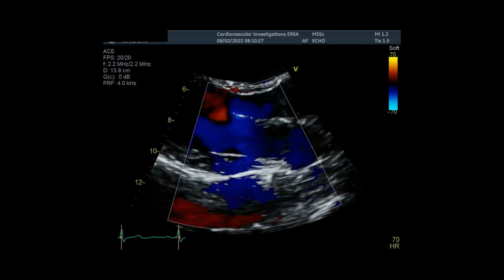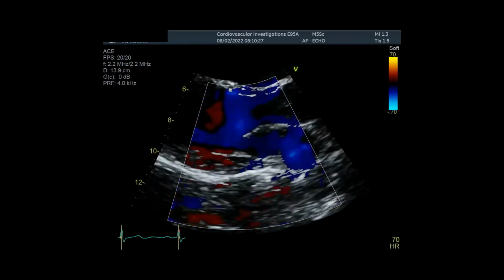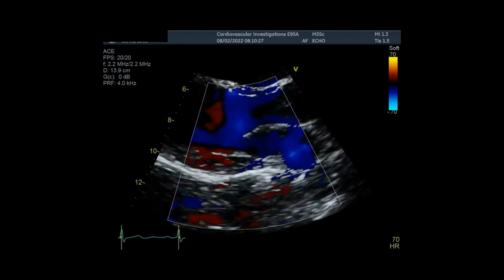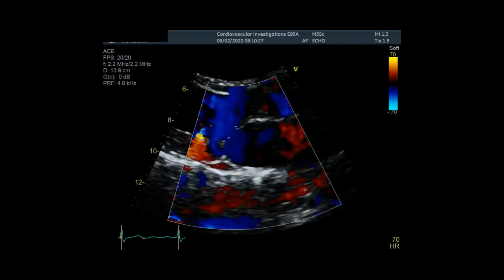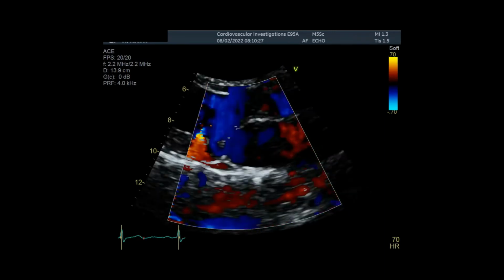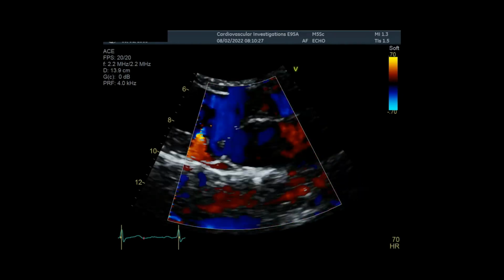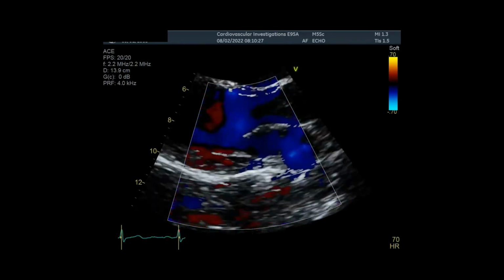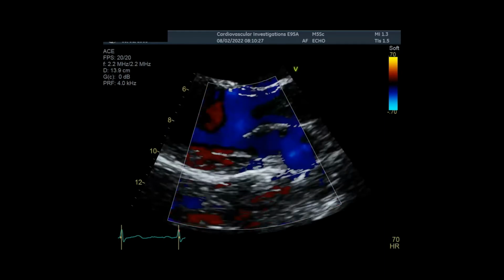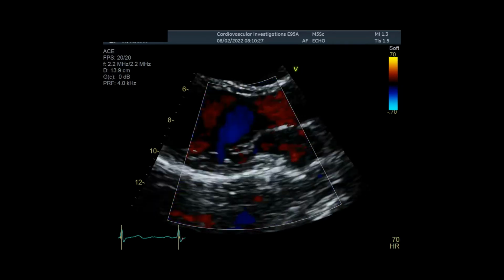This looks busy with blood flow kind of going everywhere, it looks like. But what you're really looking for is whether there's a jet of blood flow back into the LA from the LV during systole, and whether or not there's an indication of very high velocity flow through the mitral valve. And again, until you get your eye in and you've looked at more echoes, you may need to freeze and slow your image down so that you can time it with your ECG and really make sure that there's no regurgitation in particular there. This is normal. It does look a bit busy, but it is normal.